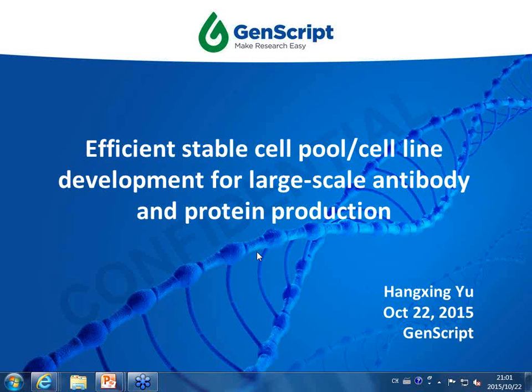The topic for today's webinar is efficient, stable cell pool cell line development for large-scale antibody and protein production. As many of you would know, two expression vector systems dominate the antibody production in mammalian cell culture. One is based on Dihydrofolate Reductase or DHFR genes, and the other on Glutamine Synthetase genes, the GS system.